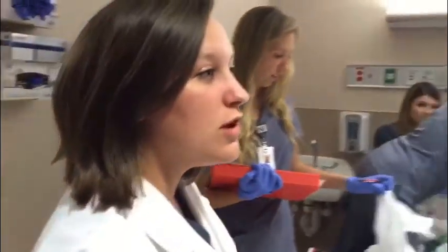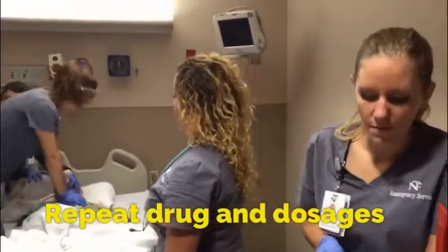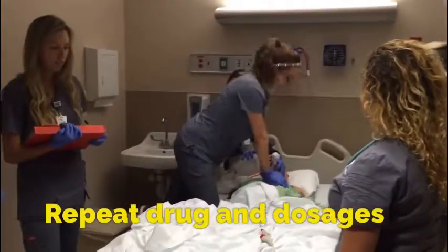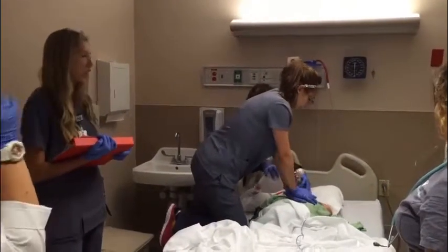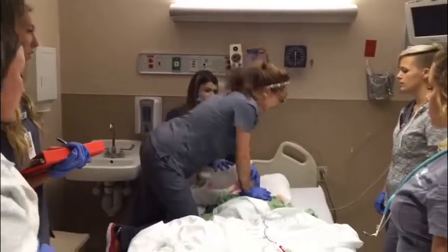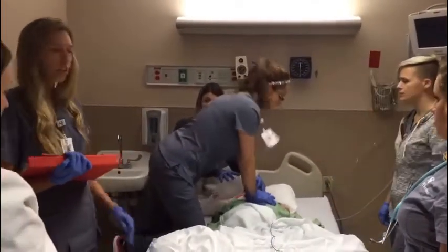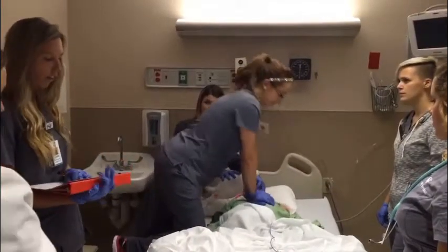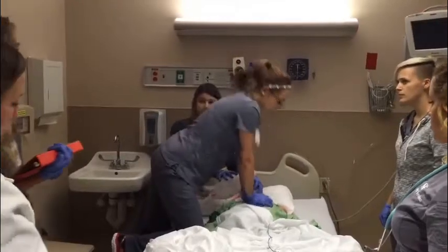Amy, could you please pull up 300 milligrams of amiodarone? 300 milligrams of amiodarone being drawn up. Thank you. 30. All right. Good compressions, Ryan. Thanks. 300 milligrams of amiodarone given. That's the first dose. Let's switch compressors again.